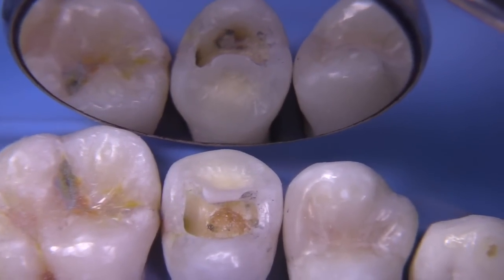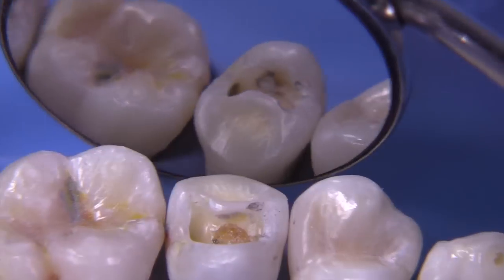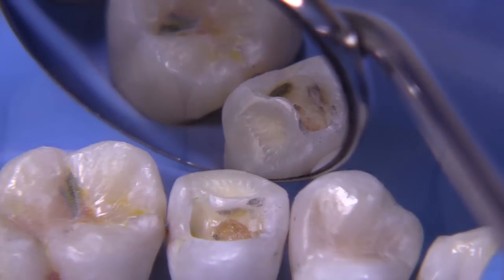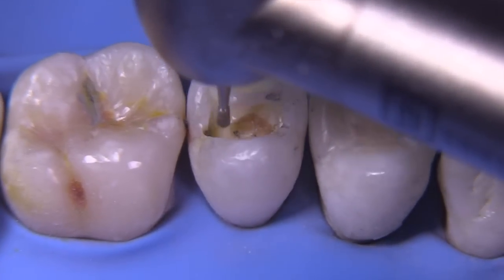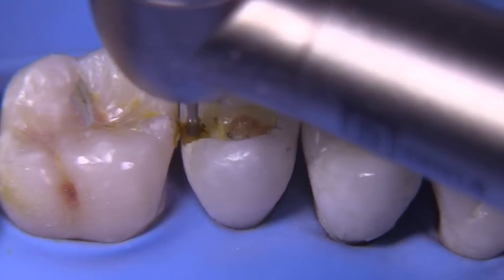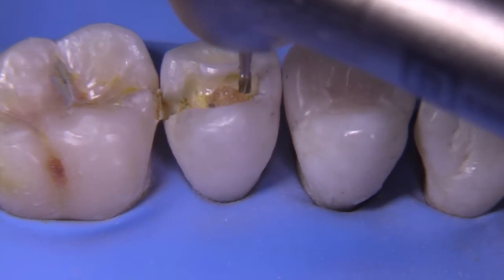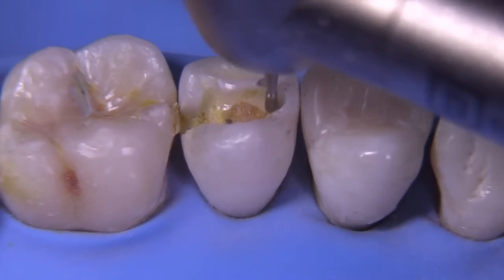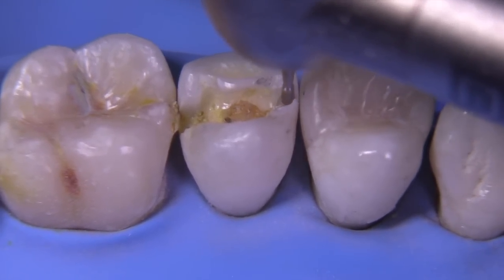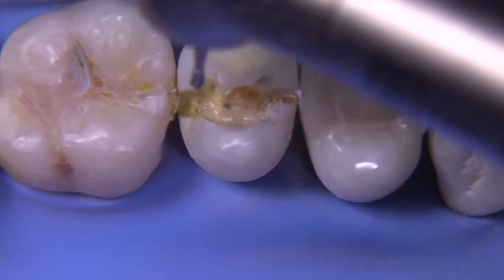Looking in the mirror, we can see there's still some amalgam and caries remaining underneath that lingual cusp, and caries definitely present on the distal. We're going to make a slit out towards the distal — and we can verify there was indeed lots of decay there. Because on the radiograph we show caries on the mesial, we're going to make a slit towards the mesial as well. Yep, there's the caries.